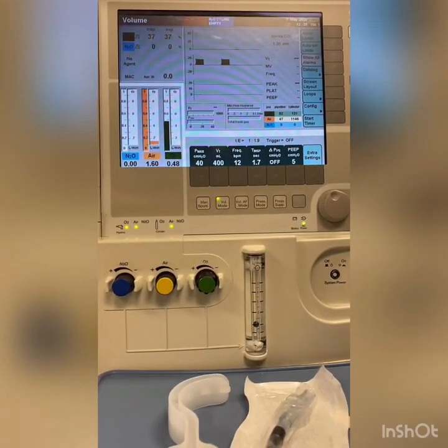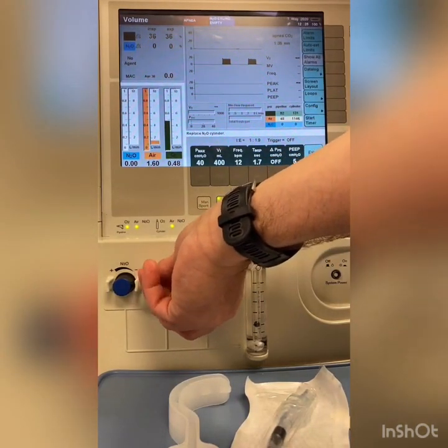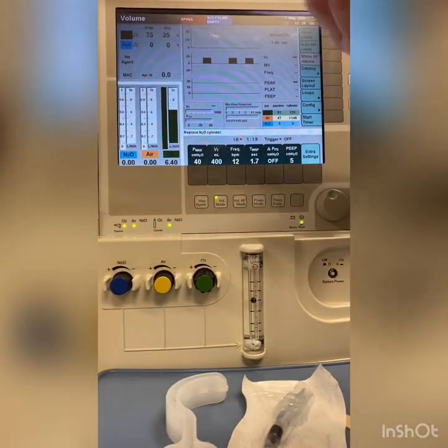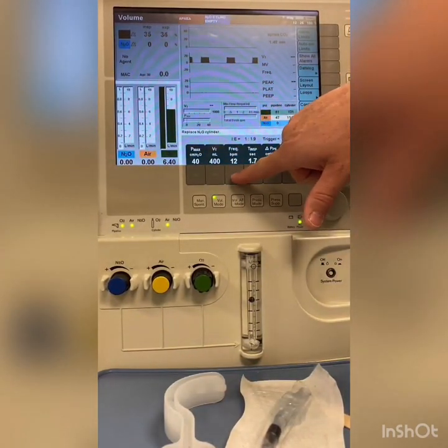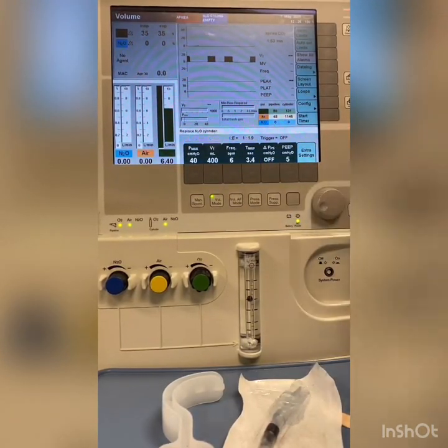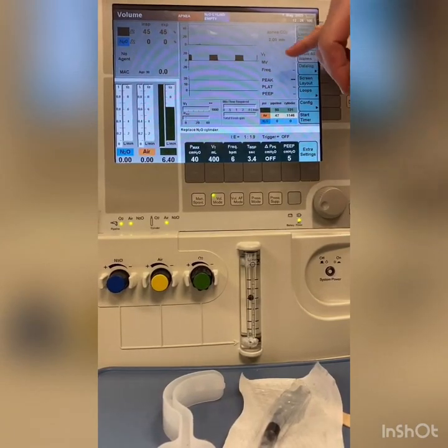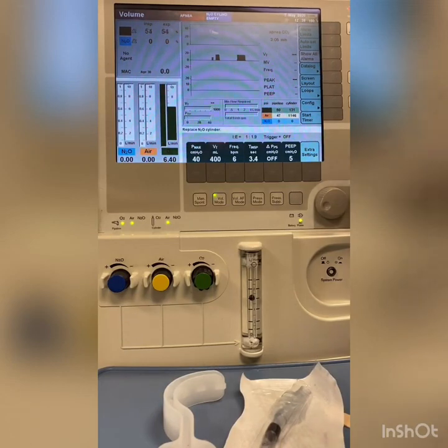So now we're done with our maintenance of our case. That means emergence and induction are the same: 100% oxygen, high flows. As you can look at our emergence video, you'll see in there that Kelsey went ahead and decreased our rate, and that's what I want you to do. I was at 12, let's cut it in half. Then they're going to keep breathing. Well, when they start to breathe, we're going to see that our rate will end up being more than 6. Now we see that's one indication that, hey, they're breathing on their own.